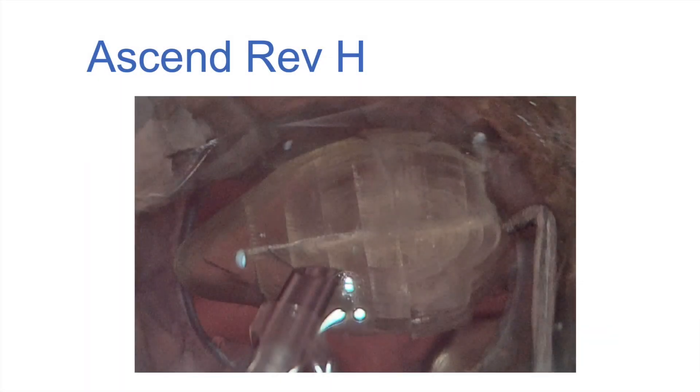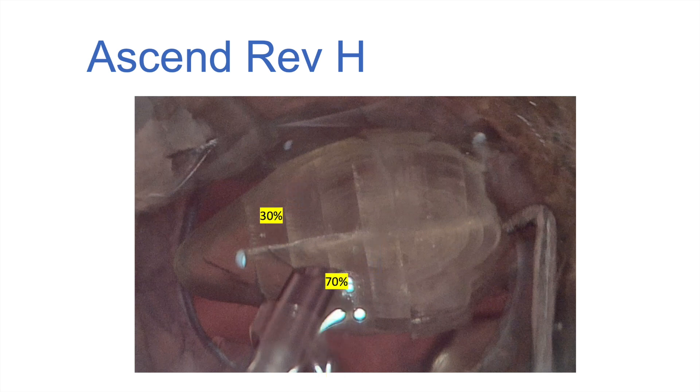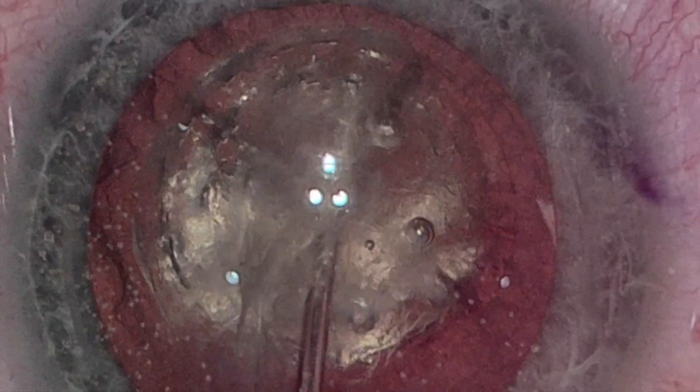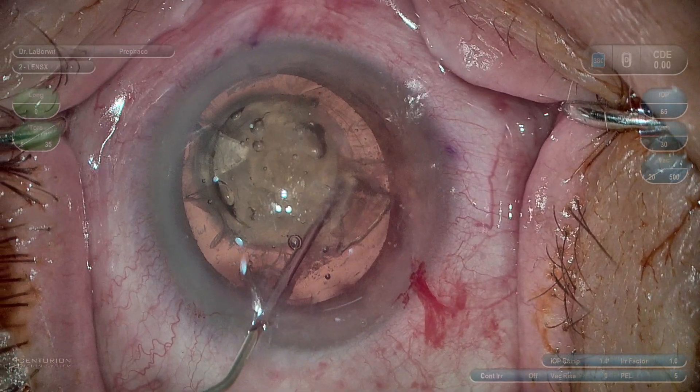This is a coronal view of an actual lens that had the laser application. It shows that without the horizontal cut you would have these long cylinders that would be more difficult to pull up and remove. By bisecting these long cylinders into smaller pieces they can more easily be removed with the phaco or second instrument — I like to say it's more like a tater tot instead of trying to pull a french fry. You can see the horizontal cut was placed at 70% depth, but keep in mind you still have a 500 micron cushion of the posterior capsule. Here I am hydrodelineating along the horizontal cut and then easily lifting up the laser cut cylinders because they are not long pieces — they were bisected in half.